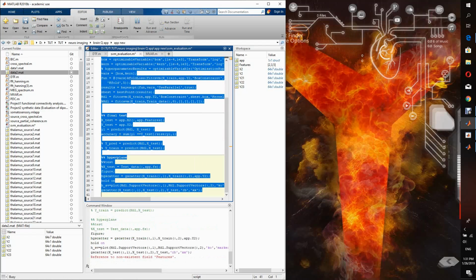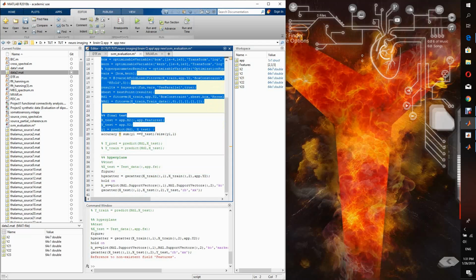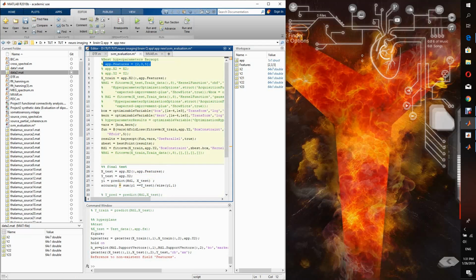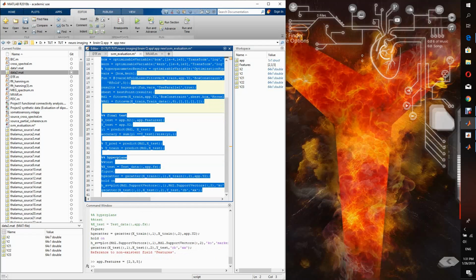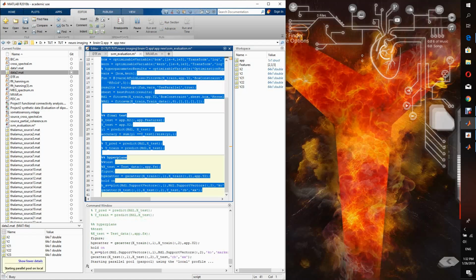It's called BrainQ, and the application version is called BrainQ 2. So now let's wait for the results.